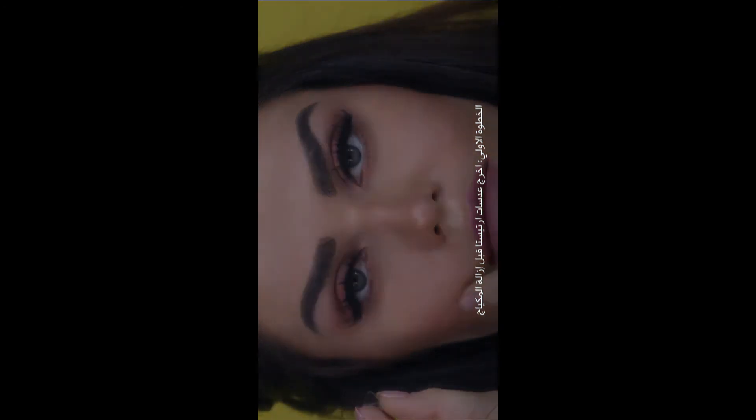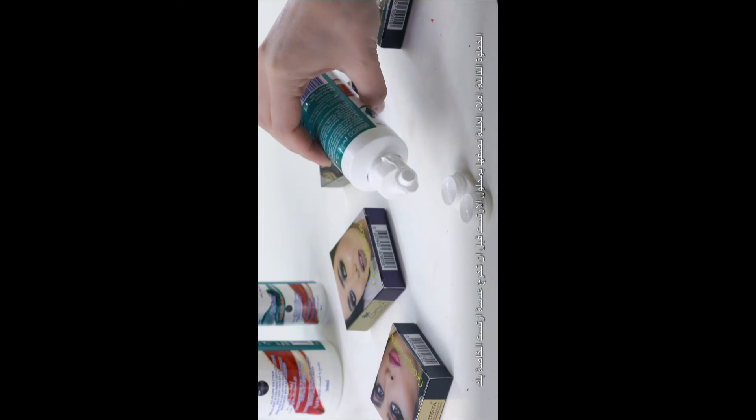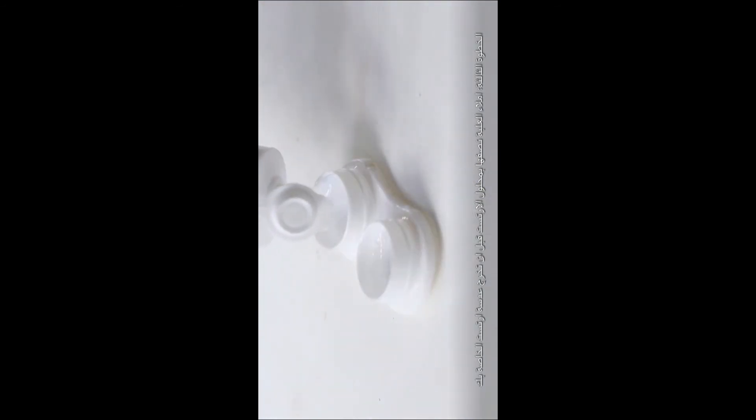Step 1: Take out your Artista contact lenses before you remove your makeup. Step 2: Make sure that your hands are clean before you remove your contact lenses. Step 3: Fill your case about half way with Artista solution before you take your Artista contact lenses out.